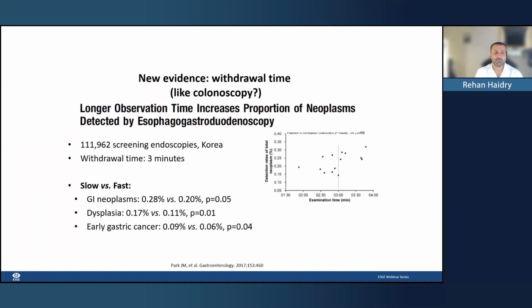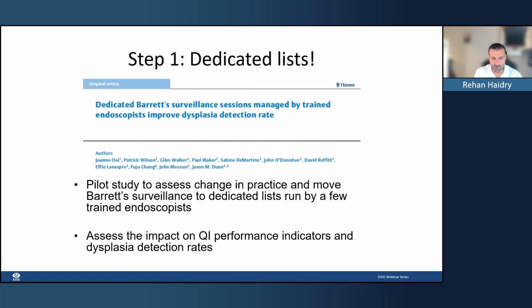So take your time, put the timer on. If you're more than 7 minutes, then you've given your patient every chance to show you something. Again, this is a nice study published in Gastroenterology: longer observation time increases proportion of neoplasia in upper endoscopy, from Korea.